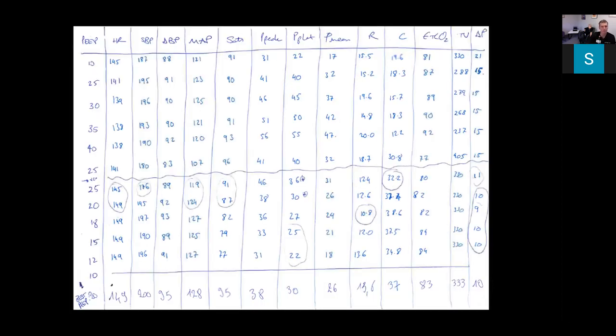But you get the idea that you could start getting a whole bunch of data: hemodynamic data, ventilation data, as well as echo data potentially, where you can get an idea of where the optimal PEEP would be based on looking at the hemodynamics, your plateau pressures, and your resistance and compliance, and trying to look at where you get the best change in pressure, getting your biggest bang for your buck in terms of the volume. Or the other way around, if you have a fixed pressure gradient, driving pressure, having a look at what you get the biggest volume for would be the way that I do it now.